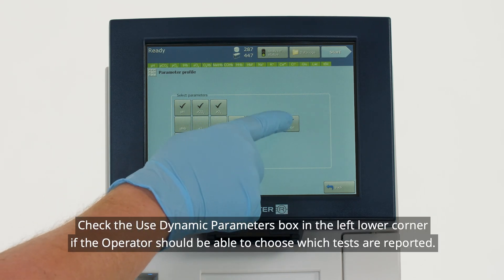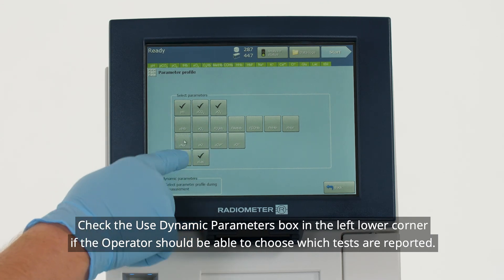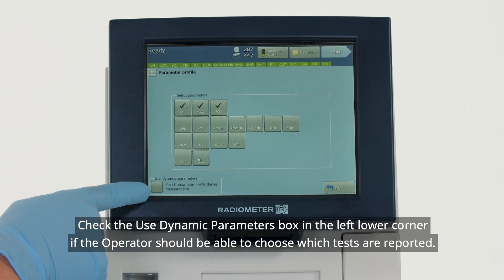Check the Use Dynamic Parameters box in the left lower corner if the operator should be able to choose which tests are reported.